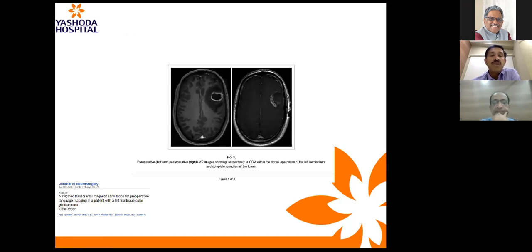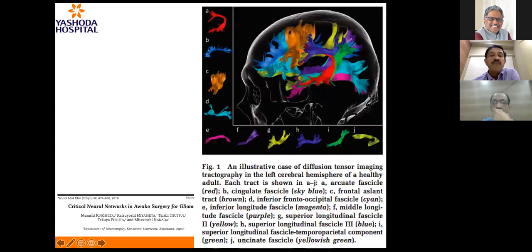Now, this is what is doable even before doing the craniotomy. So when you do the craniotomy, at times you need not even keep the patient awake. You can directly go in and resect the tumor without having to struggle for locating the speech area. Sometimes you may have false negatives, like a wrong technique, or the patient may not be cooperative. In those cases, this becomes very useful. So this is for localizing the cortex.